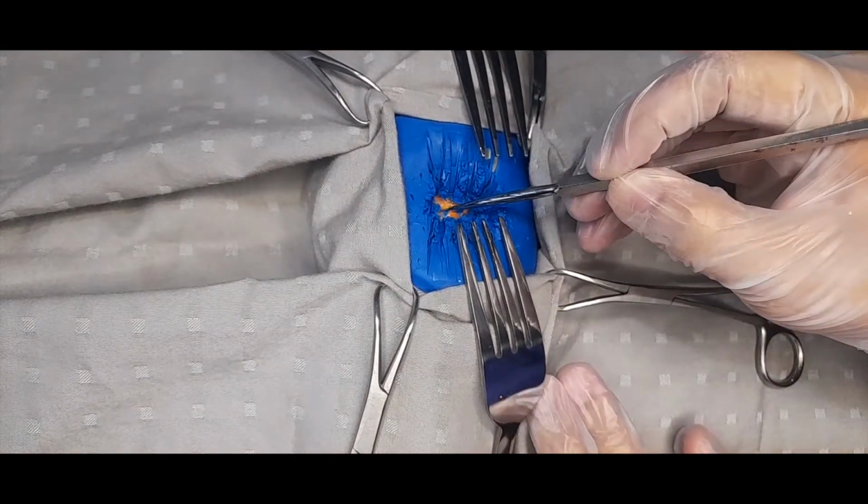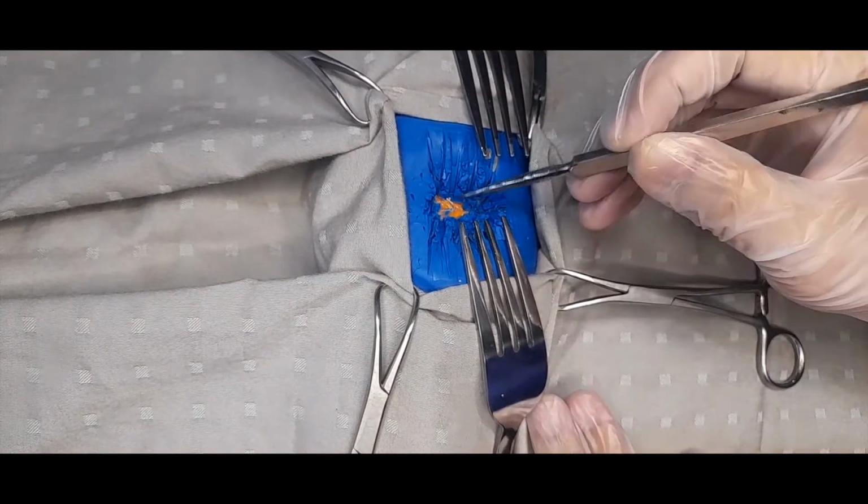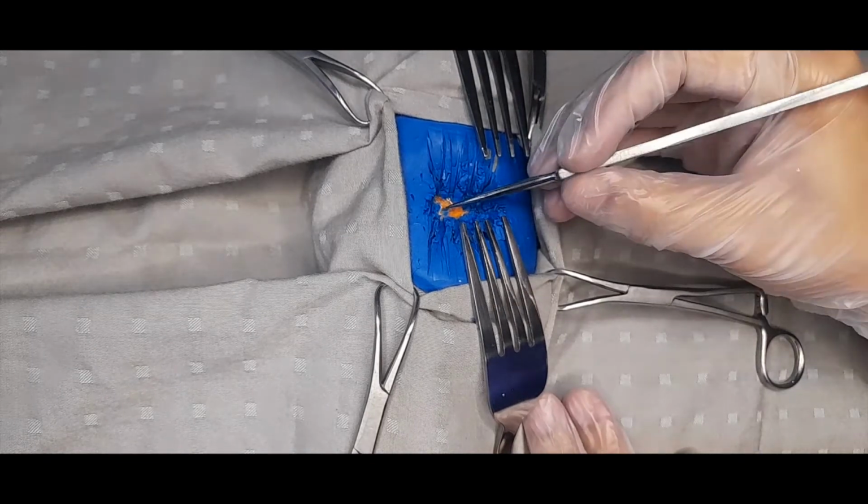The subcutaneous tissue is then dissected using electrocautery.